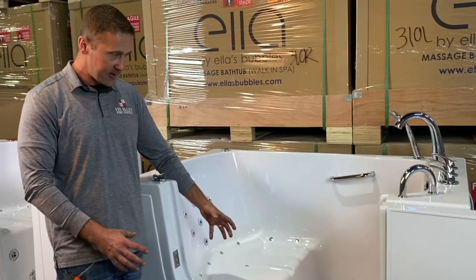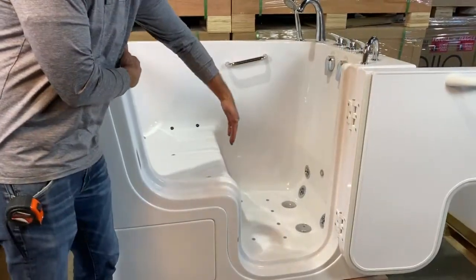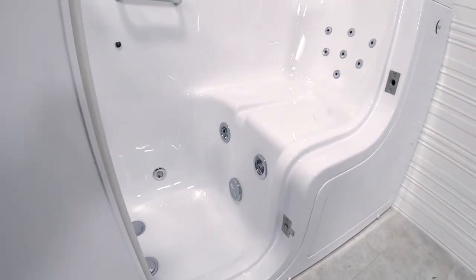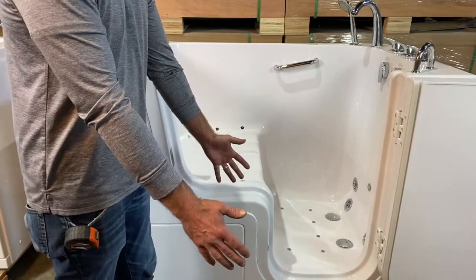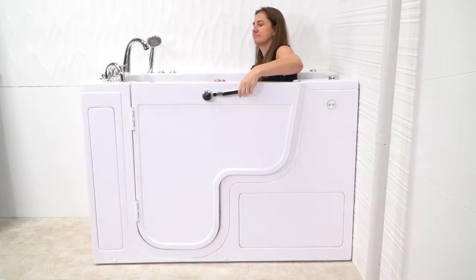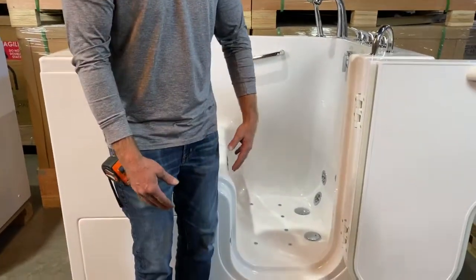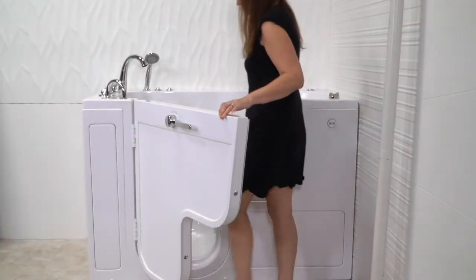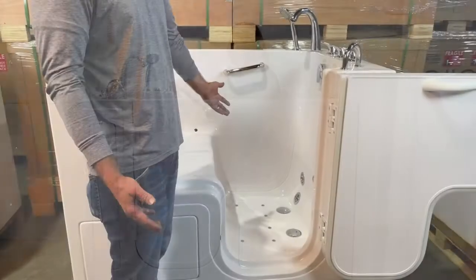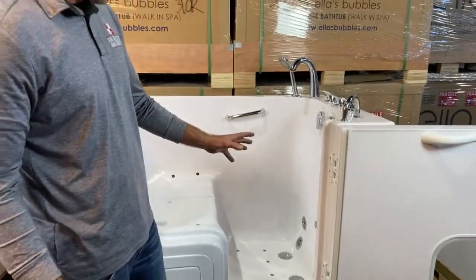A couple things to bring to your attention. When you're getting into this bathtub, the big difference is there is no sidewall next to the seat. A bather would approach this one of two ways. One, wheelchair — wheel right up next to the bathtub, drop the arm, transfer right into the seat, close the door behind you. A second option is a more mobile bather could come up to the bathtub, sit down in the tub, swing your feet in. A third option is just stepping in, having plenty of room, and sitting down like you would any walk-in bathtub, but still having this wide-open access.